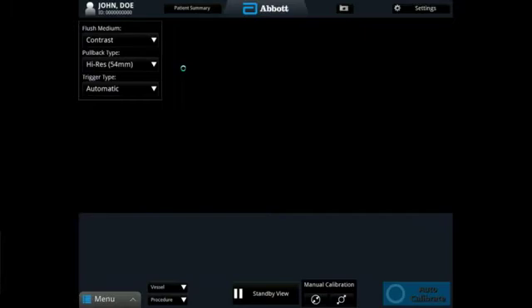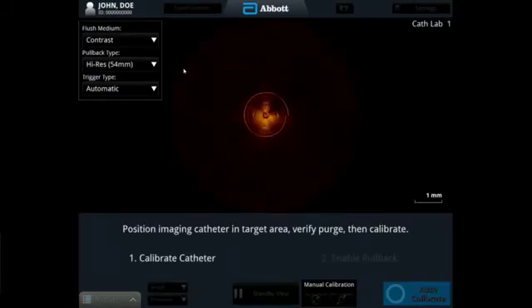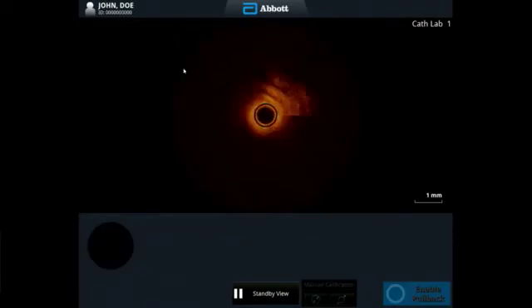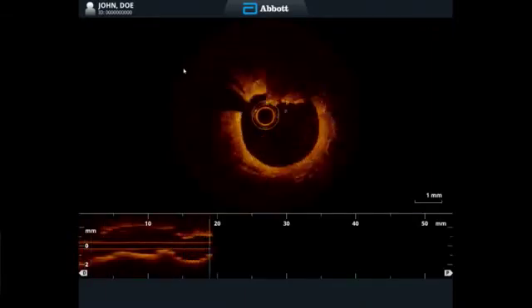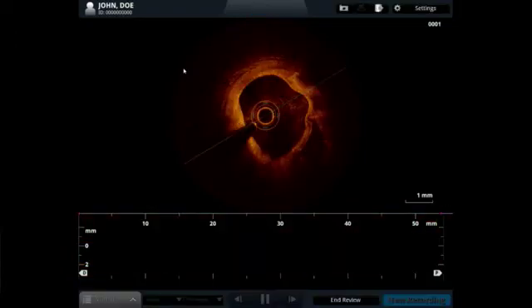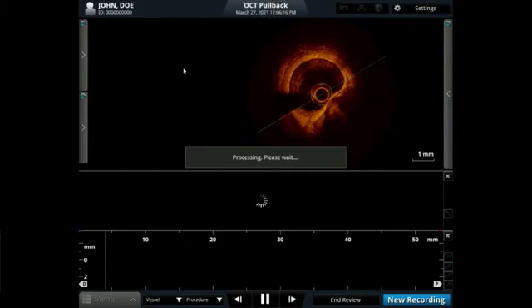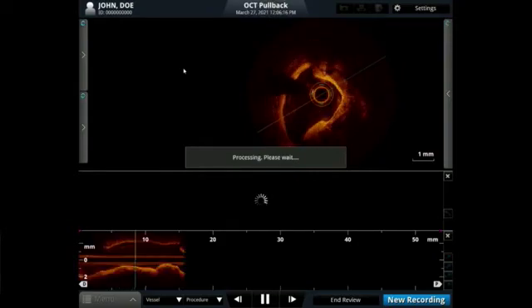Let's see the measurement live now. Auto calibrate. Just make sure I have no contrast here. Looking good. I don't see angio co-registration on your screen. We don't have it installed yet. They're installing next week. You know, that's a game changer. The 3 mm balloon, starting with the 3 millimeter balloon, moving up with the Shockwave is exactly what's going to happen. Looking good so far.